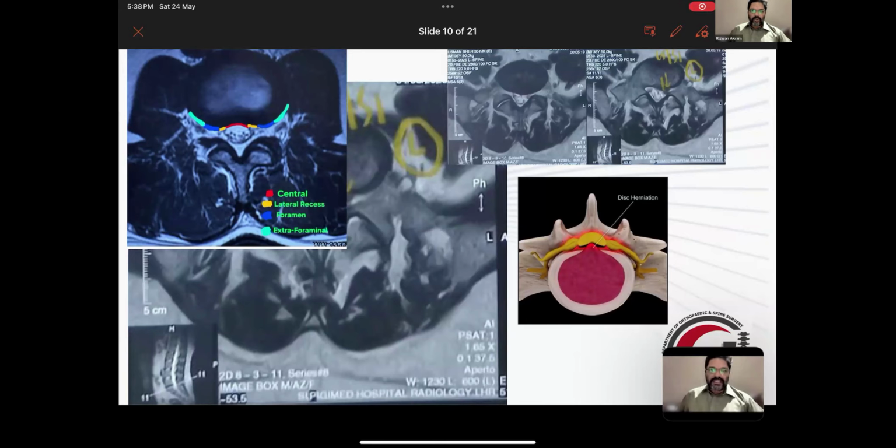And secondly, overall, all the working portal uniportal endoscopies have things which are disposable, and the patient has to bear the cost of that. So my shift was due to the cost per patient, which the patient has to bear. That's a very clear explanation. Thanks, Rizwan.